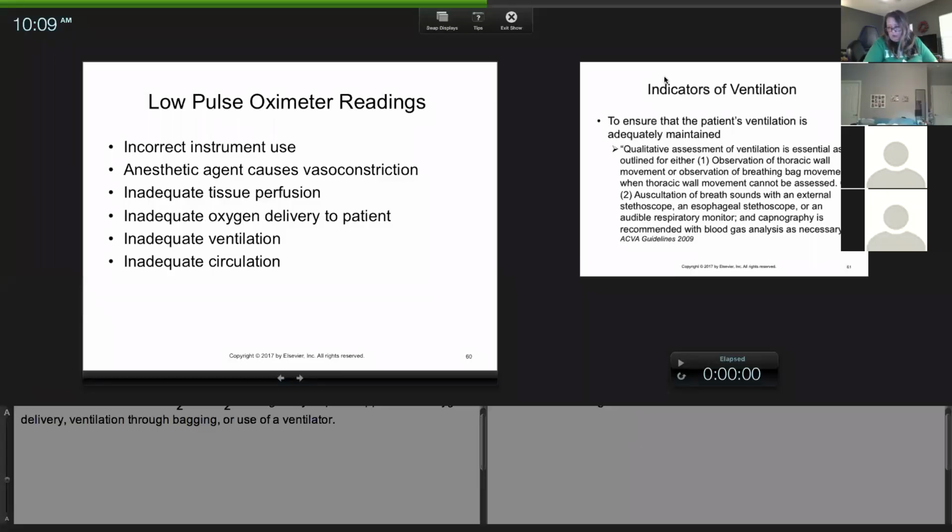Okay. So let me walk you through what I would do if I had an issue. I'm going to verbally say this, but I'm literally going to write this down on a piece of paper. If you want to take some notes, I always encourage that, because when you actually write things, there is a checklist in my head. Eventually we're going to create some type of monitoring cheat sheet for you to have in surgery rotation, because nobody has issues.